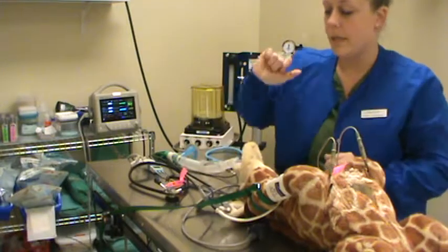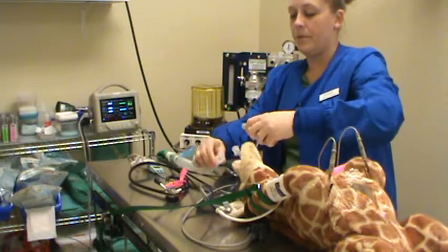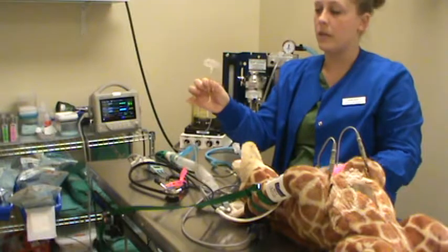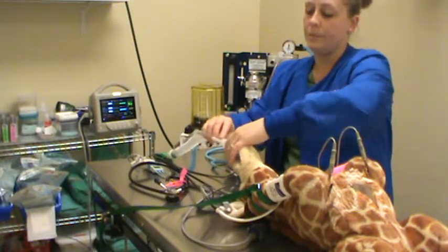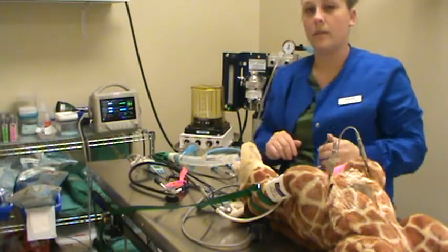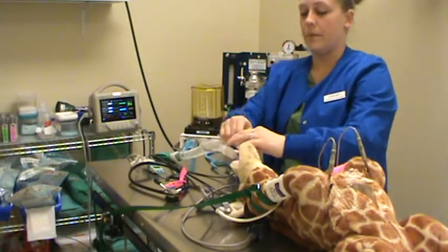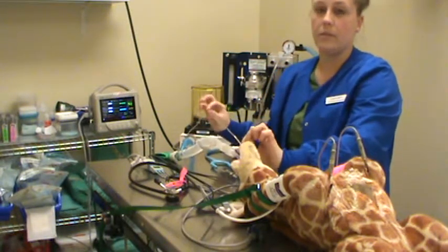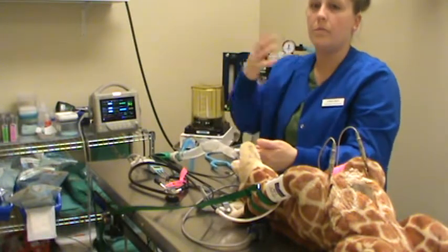So that's good. The next thing, last thing we would hook up here is our capnometry. So we have our little side stream capnometry probe here that hooks up directly to the endotracheal tube and then to the anesthetic circuit. And then it's going to take a reading of the exhaled CO2, the expired CO2. So the patient breathes out, the little cord here has an infrared sensor and machine that's going to read that exhaled level of CO2. So we call it an end tidal CO2 because it's the end of your tidal volume.